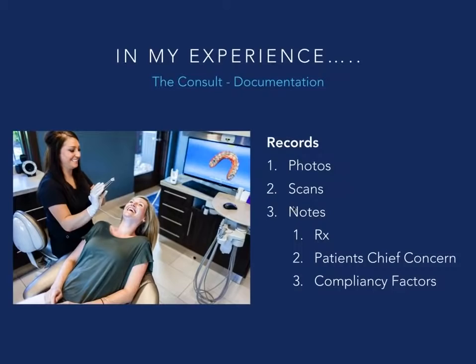This is actually a picture of our office, by the way. Most of the photos here are taken in our practice. This is Amanda, our Invisalign coordinator, using one of the CEREC machines to scan a patient, and you can see how we use those to have the dialogue with the patient on what's needed.